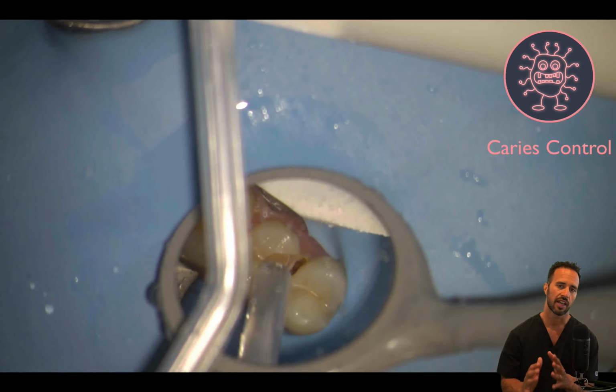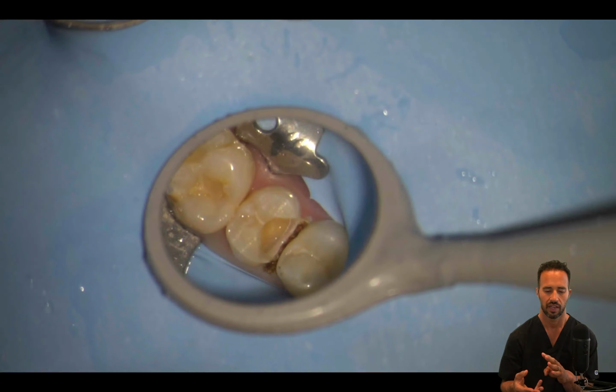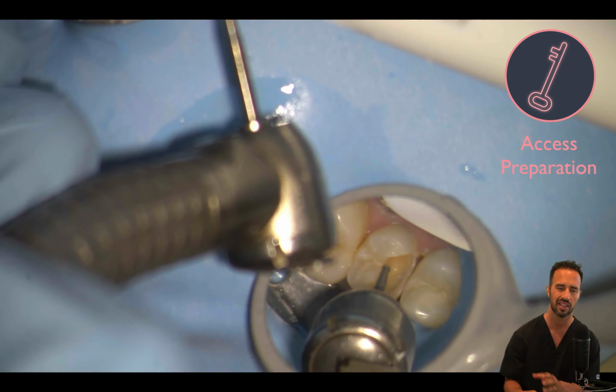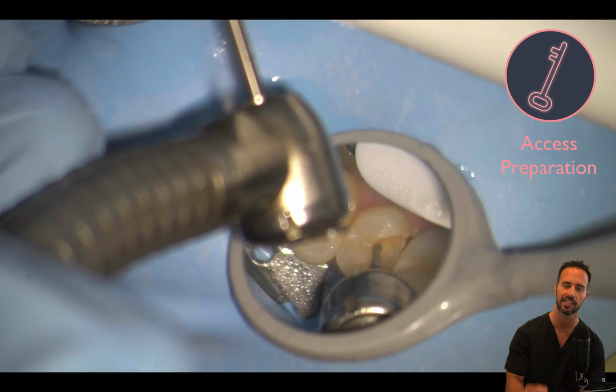It's important to take your time, okay? If caries is in the way of where you're working, number one, it's easy to lose angulation because you don't have really obvious anatomical landmarks, and number two, you can't see any potential cracks that might be present. All right, so now we're getting into our access preparation.